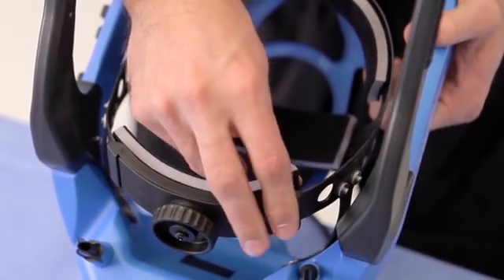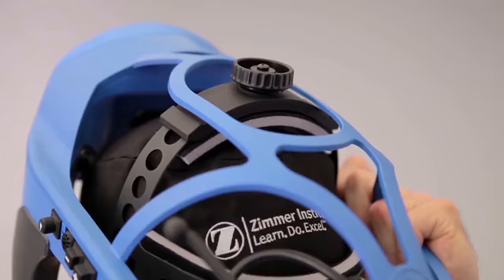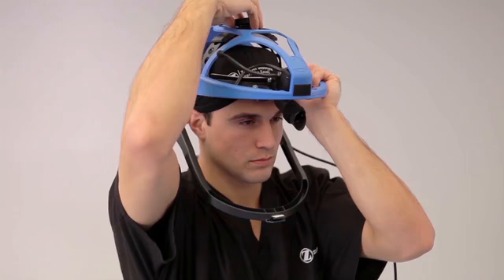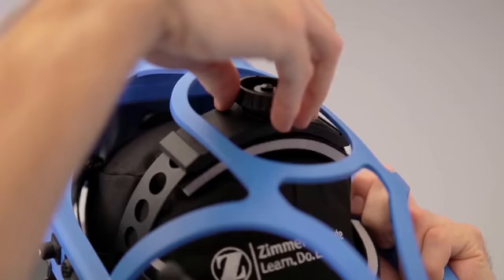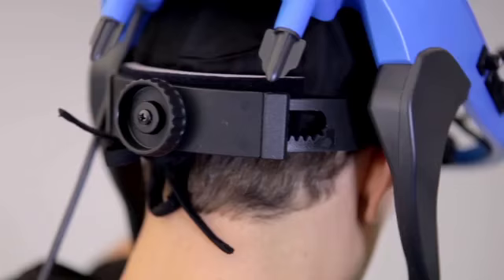Place the helmet on your head, ensuring your field of vision is clear. Now adjust the helmet for comfort. Turn the headband top adjustment knob until a comfortable fit is achieved. Then turn the headband rear adjustment knob to secure the helmet for a comfortable fit.